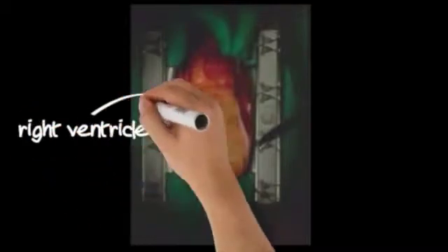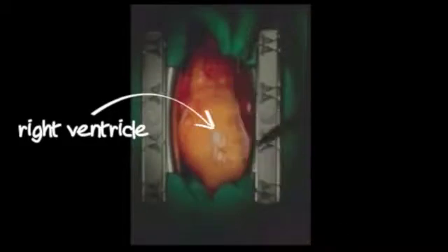Once the pericardium is opened, the first heart chamber that is revealed is the right ventricle. The aorta is palpated for calcification and the ease of placing the bypass cannula.